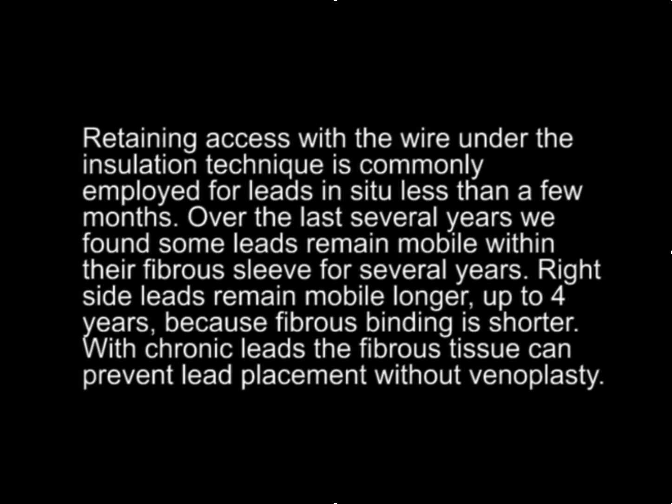Retaining access with the wire under the insulation technique is commonly employed for leads in situ less than a few months. Over the last several years, we have found that some leads remain mobile within their fibrous sleeves for several years. Right-sided leads remain mobile longer — up to four years — because the fibrous binding is shorter.